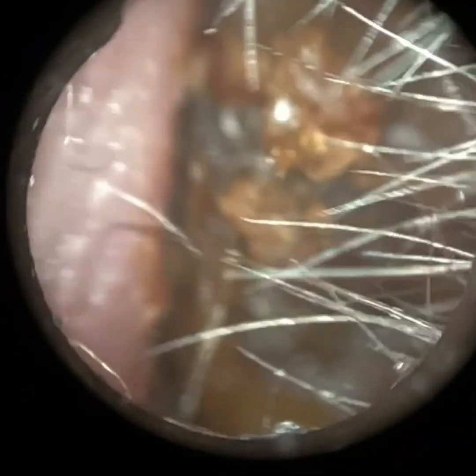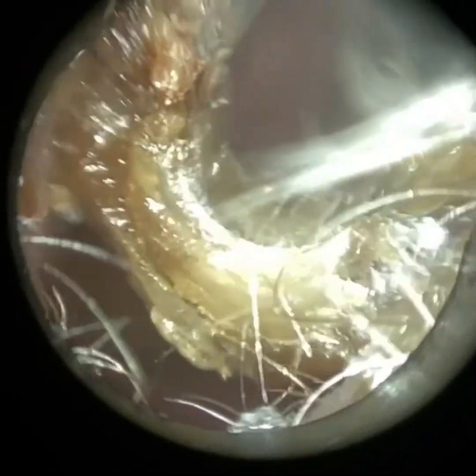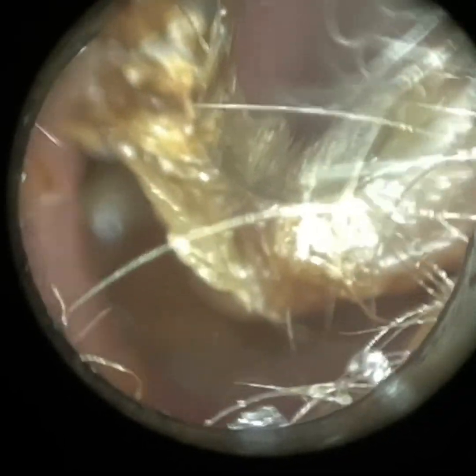You can see a bit more keratin on the floor of the canal and on that aspect of the plug — that white glossy piece of skin. Now it's more or less mobilized, and I'm trying to wriggle this forwards and out. So that's the first bend just to the right, and the flesh you can just see to the left-hand side is the second bend. So I'm just meandering it around that area, where the ear canal is at its bendiest and twistiest. I'm going to the top where I can get a better suction grip and just bringing it down, moving the plug from right to left. So we've just mitigated that region between the first and second bend.